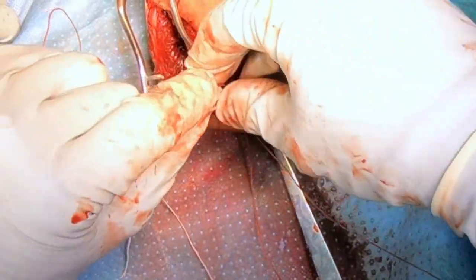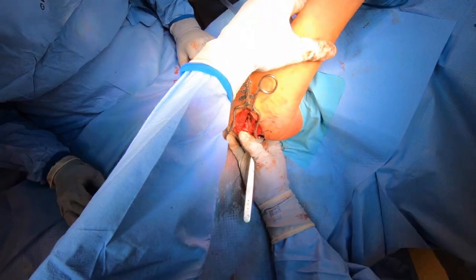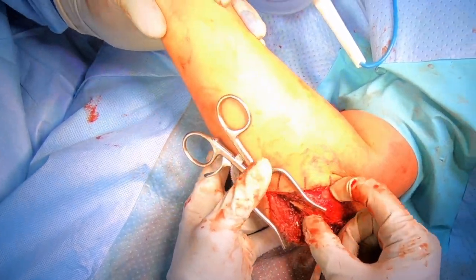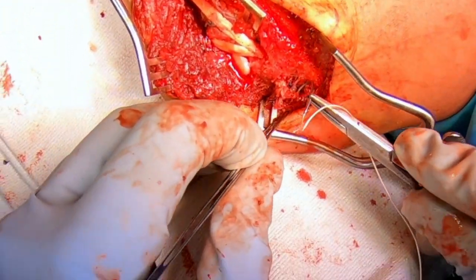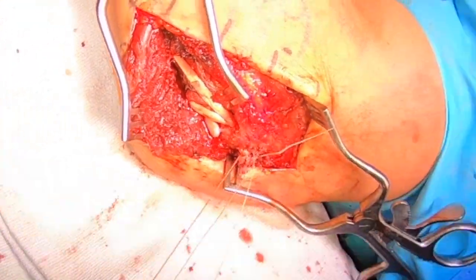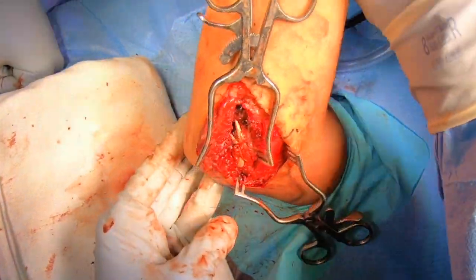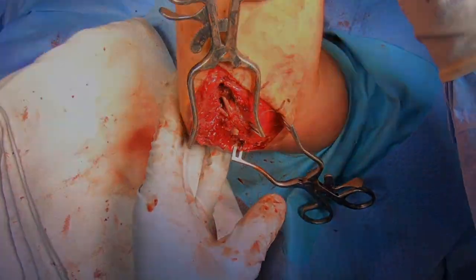Now I tie the graft itself to each other — so this is both a repair and a reconstruction. Here are the ends of the graft being tied together and cut. The elbow is now totally stable. You can see full range of motion — full flexion, full extension. If I try and rock it, you can see I'm trying so hard it's even moving my head and the camera, but zero signs of instability or further dislocation. We'll sew the graft ends together in addition to the prior sutures to be sure they'll heal, and sew the graft limbs to each other in what's called a yoke stitch to spread the graft tissue over the ligament itself. We confirm once again that the kinematics of the elbow look good, and with this, we're essentially done. Thank you so much.